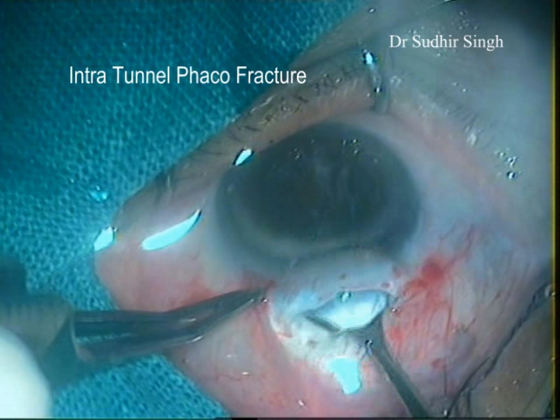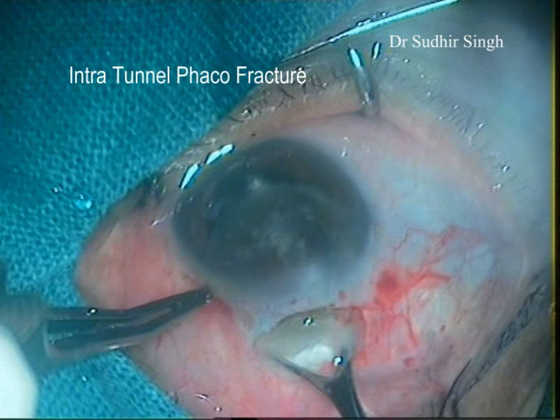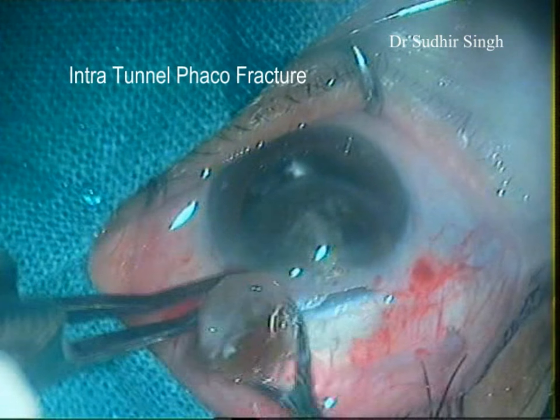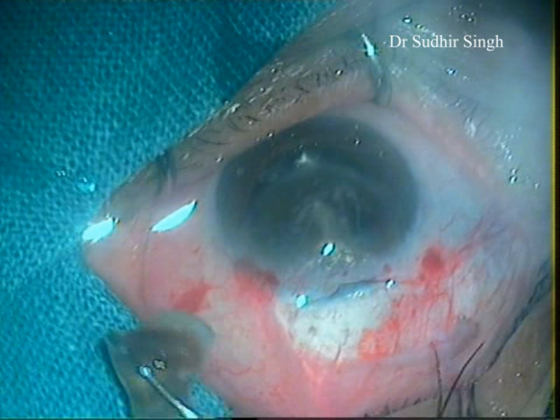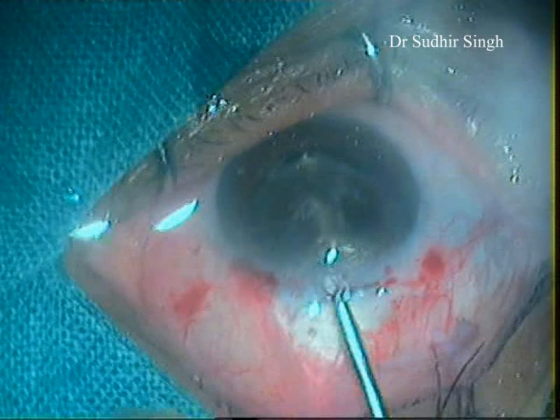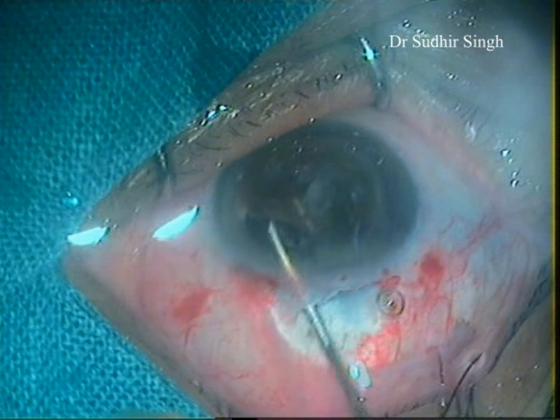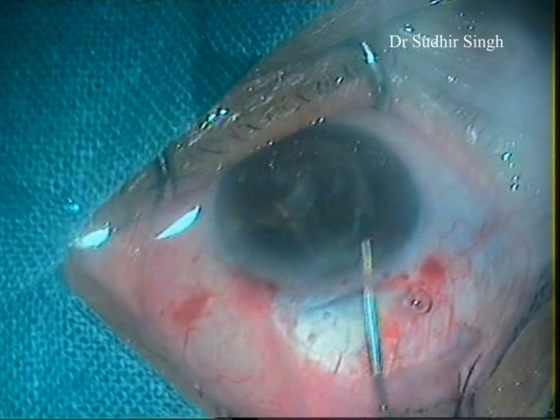When the nucleus is engaged in the tunnel, the vectus is pulled posteriorly and upwards. This causes breaking and removal of a part of the nucleus, while the other part remains engaged in the tunnel. The engaged part of the nucleus is pushed back into the anterior chamber and rotated so its longitudinal axis coincides with the longitudinal axis of the tunnel.